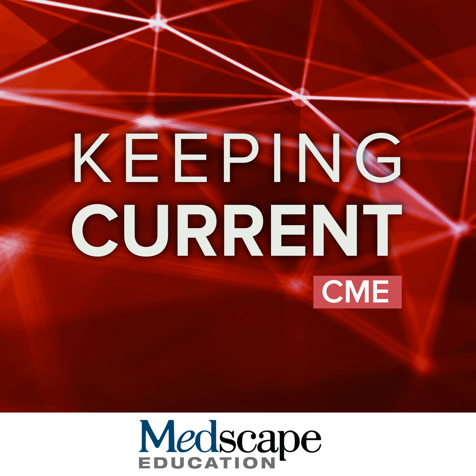ARIA-E is parenchymal edema or sulcal effusion detected on the T2 FLAIR sequence. ARIA-H is microhemorrhages or superficial siderosis detected on a GRE or SWI. For optimal ARIA detection, imaging and ascertainment of ARIA should be performed in a consistent fashion, and that may be aided by use of dedicated orders and imaging protocols. And finally, clinical history is key in differentiating ARIA from other processes.